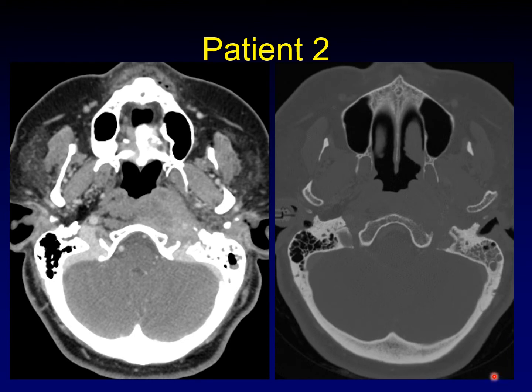Here's patient two. This time on the left side, we have a lot of fullness in the soft tissue right at the skull base, and you can see erosions along the anterior clivus. A breakdown of that nice cortical rim gets ratty and disappears entirely. Again, erosions of the central skull base and a soft tissue mass.